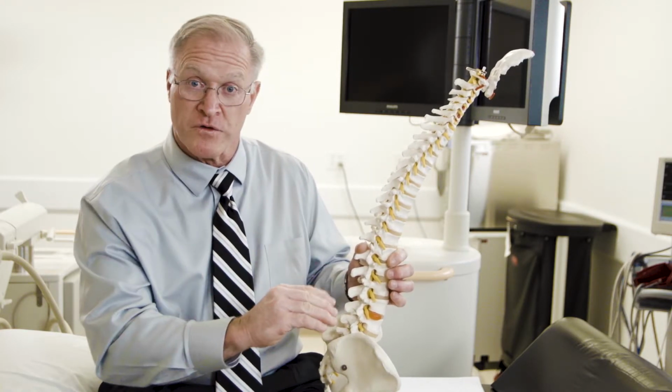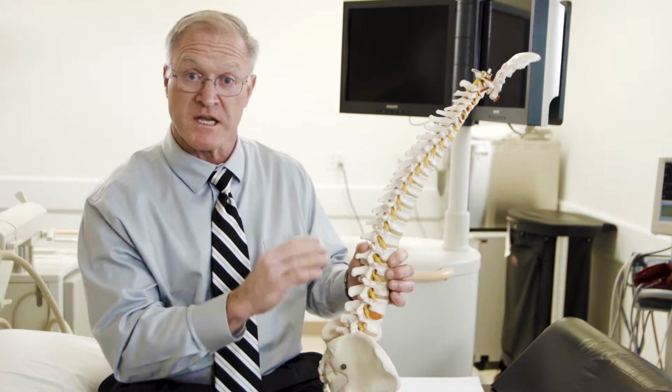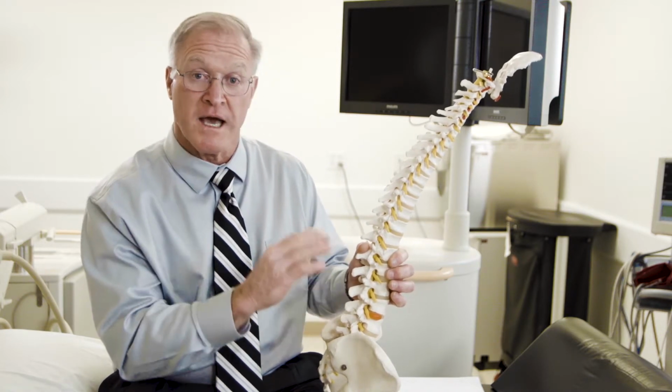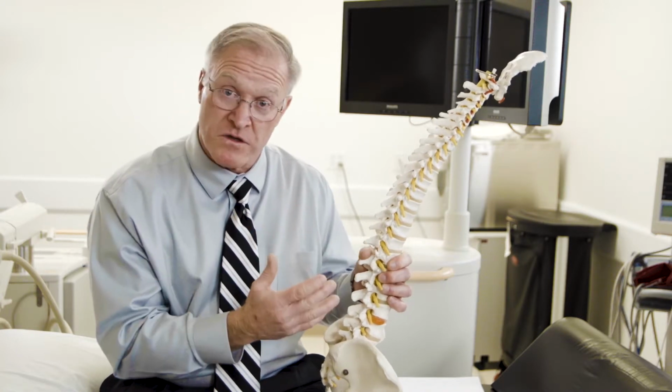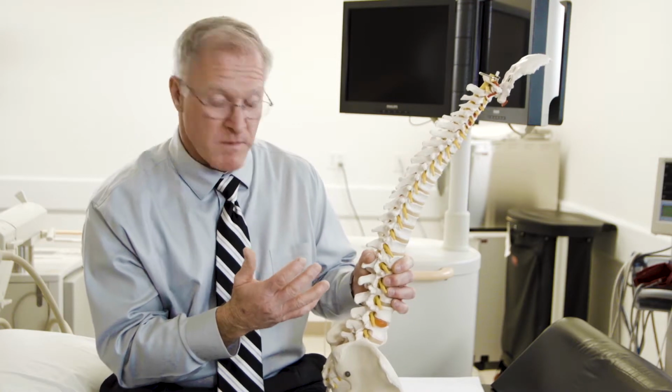As that medication leaves my needle, I can see it coat the nerve root, and for the first time now I can see the nerve root, and I specifically want to see it coat the nerve root, and I want to see it stay there. One of the other reasons for the contrast is I want to make sure that there's not a blood vessel near that injection site that's going to carry the medication away and make it useless.